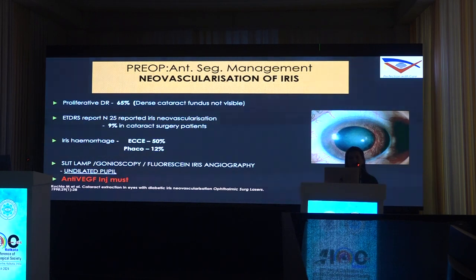Looking out for NVI, as I said, is critical because it indicates that a patient in whom you cannot view the retina may be having a PDR, and such patients would require some treatment immediately after cataract surgery. So you can plan that you may like to suture the wound in such cases, because if you are planning some intervention, either laser or intravitreal injection or a VR surgery where you cannot view the retina, you need to make sure that your wound is stable.